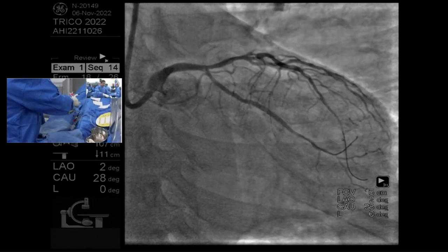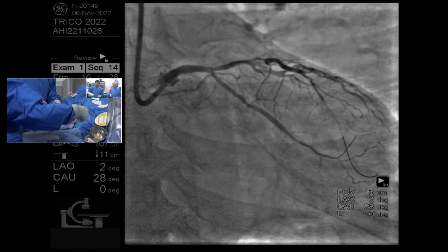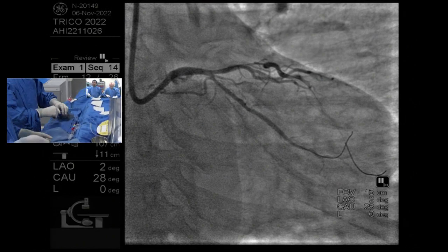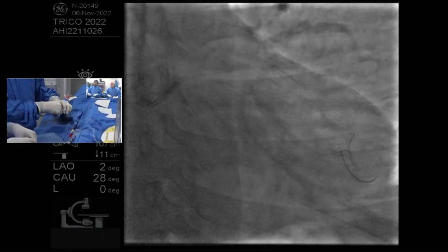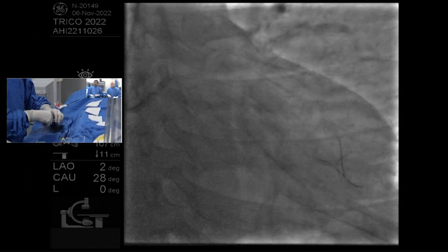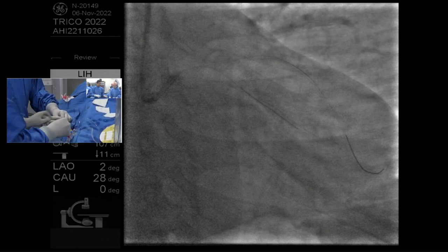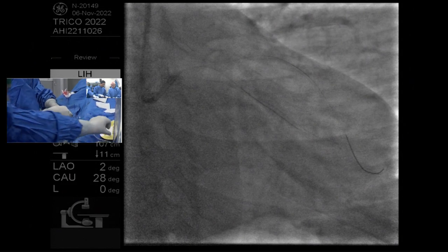We could discuss at this point, when you are putting in a stent that you think is a bit larger than the vessel, what I do, at least when I employ it, is not use a lot of atmospheres and go with under-nominal values. For example, if I don't have anything else and I need to put a 2.5 in a 2.0 lesion, then I go with, let's say, 6 to 8 atmospheres max, so that the distal edge does not cause a dissection. Although this is not recommended, I still go 2 millimeters up, and then I go with higher inflation at that point, because you have a chance of dissecting the proximal edge, but doing high atmospheres immediately could dissect both edges. Especially in a small vessel, you don't want a distal edge dissection because it will add stent in a very tight part of the lesion, where you are sometimes very limited in what you can bring.